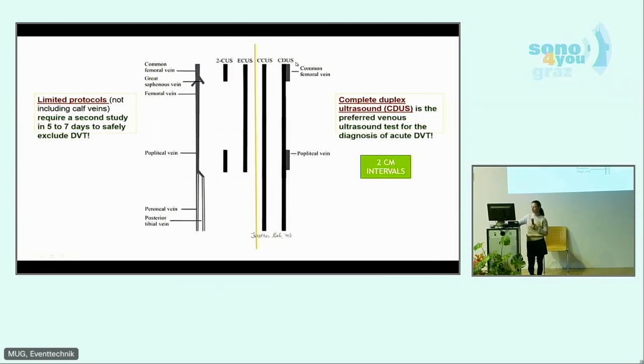So we are doing a really thorough examination of the whole leg. We are doing the compression in 2 centimeter intervals, and we are doing the Doppler examination and everything. As I said, it lasts up to 1 hour, so it's really not so realistic to do it in the emergency department. And so there is an option on the left side.